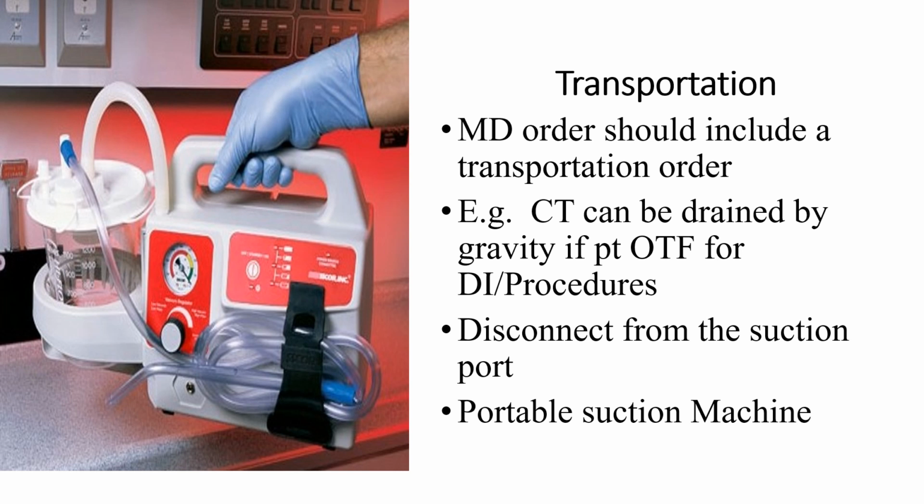If an order states that suction must be continuously applied, you will attach the tube to a portable suction machine. It is also best practice to ensure that all your connections are taped and secure according to your hospital's policy.